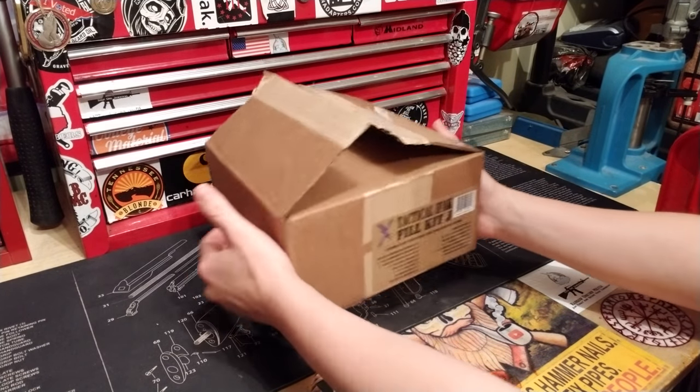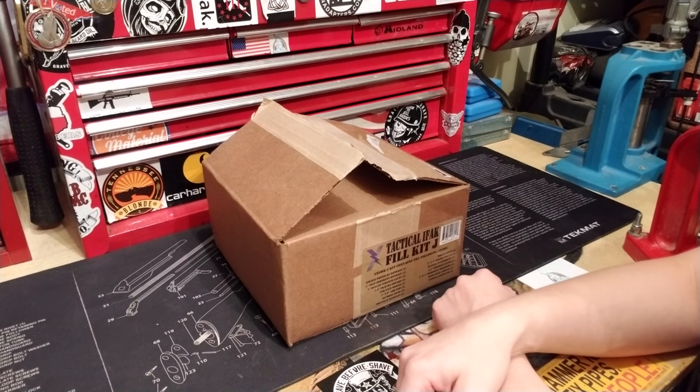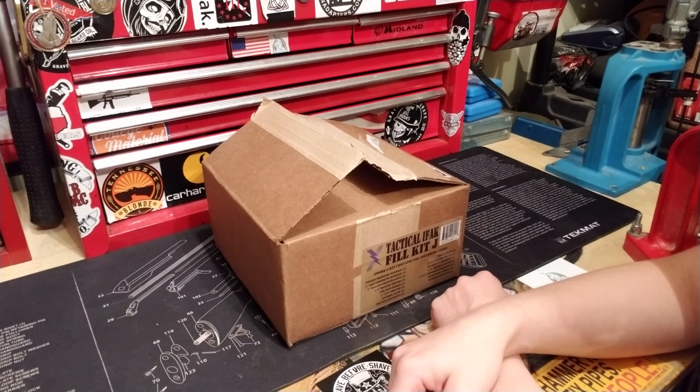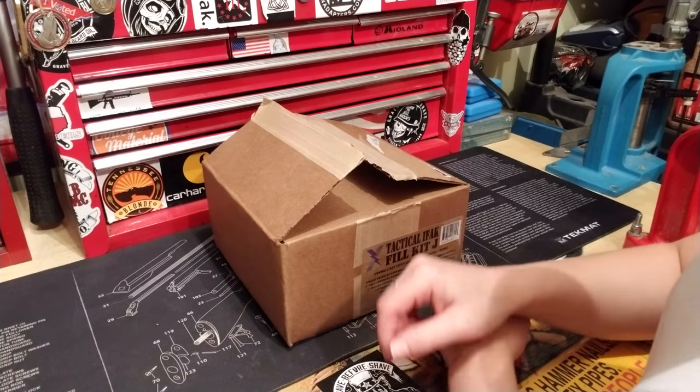It's a decent little IFAK. In a previous Medical Minuteman video, Sippy showed how you can put these kits together on your own. This one is a ready-made kit. Sippy is going to go through it and tell me if I failed — he's never seen it before, so we're opening it fresh.